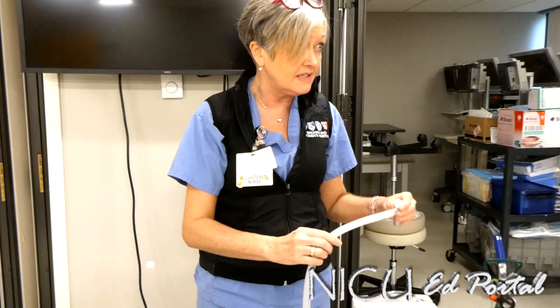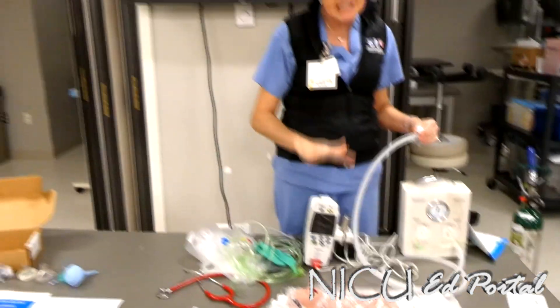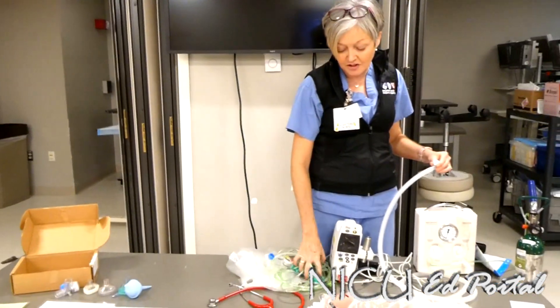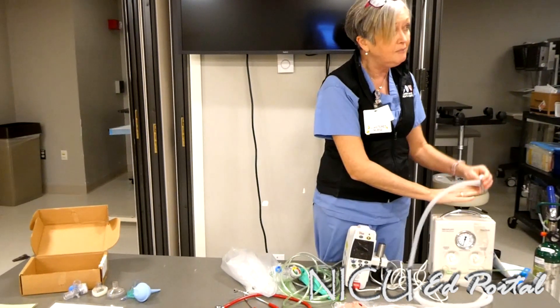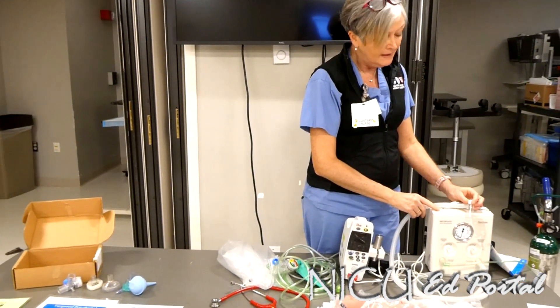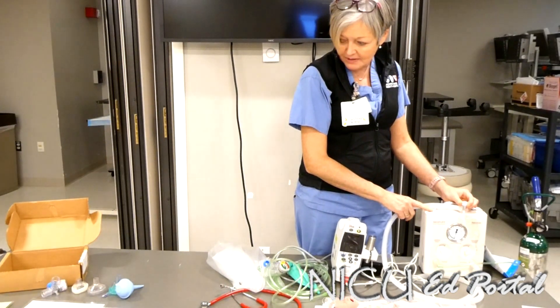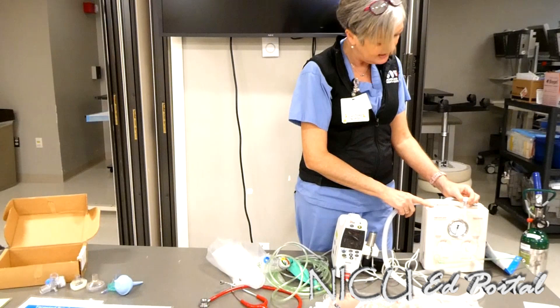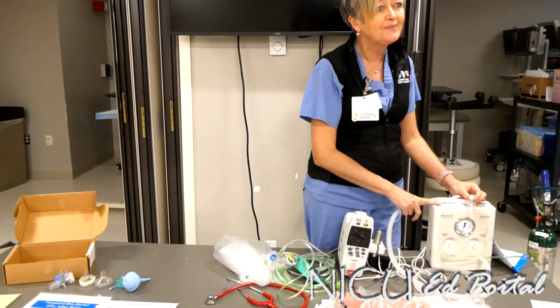That is the beauty of these T-piece connectors. At all times, with any delivery we go to, we make sure this is set up correctly for immediate use, but we try to move to the Neopuff as quickly as possible. I think that concludes everything we need to cover on this station.